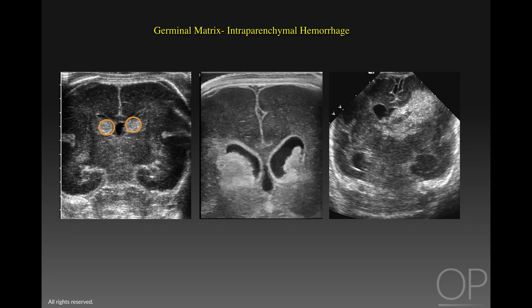These three infants show the typical pattern of premature hemorrhage, extending on the left side from germinal matrix through intraventricular in the center and intraparenchymal peripherally on the right side. These hemorrhages are typically brightly echogenic initially and gradually become liquefied and less echogenic over time.